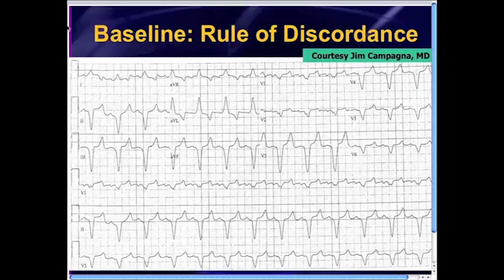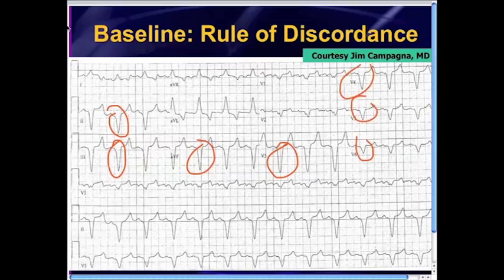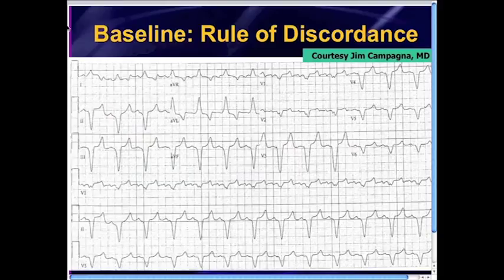Essentially what it means is that every time the QRS is mainly pointing north or upwards, you expect to see just a little bit of ST segment depression, or maybe it can be isoelectric, and that's fine also, but in every lead where the QRS is pointing upwards, you're going to see just a little bit of ST segment depression or an isoelectric ST segment. All right. Every time the QRS mainly points downwards, and there's a whole bunch of leads here in this pacemaker where the QRS mainly points downwards, you should expect to see just a little bit of ST segment elevation, or isoelectric, okay, as well. And that is what we refer to as the rule of appropriate discordance, and that should hold true in every one of the 12 leads on this EKG.